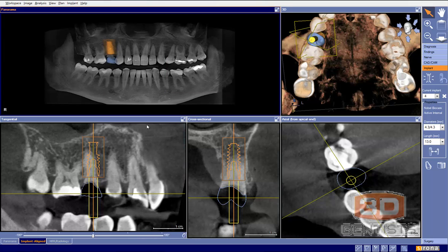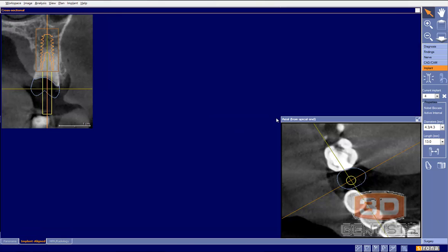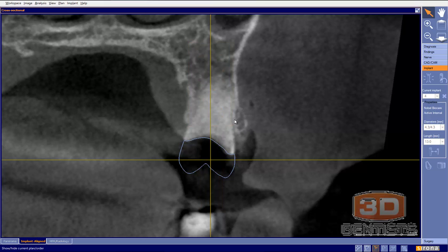All right, so if we take a look at this, one of the first things I always like to do is just visualize what it is I'm looking at. In this situation, I'll draw out where my bone appears to be, like so. I'll go ahead and draw out my tissue, which appears to be right here. And then I like to draw out my tooth, which appears to be like so. In this case, there doesn't look to be any infection or anything.